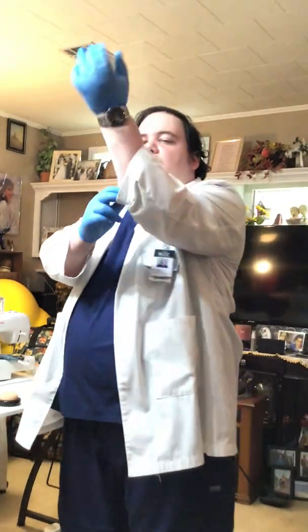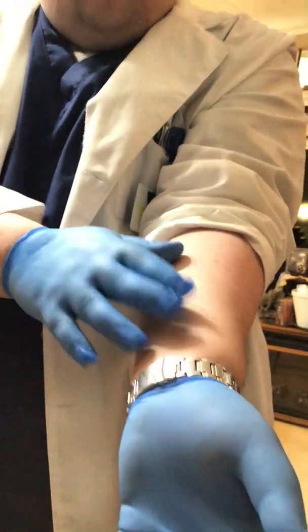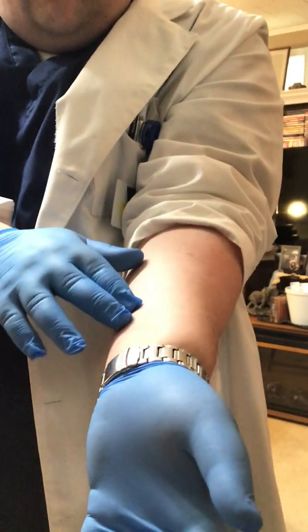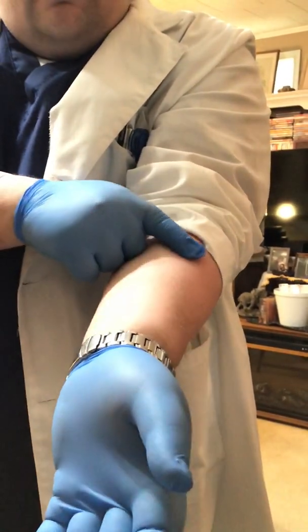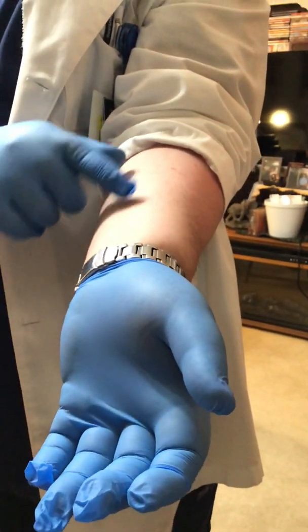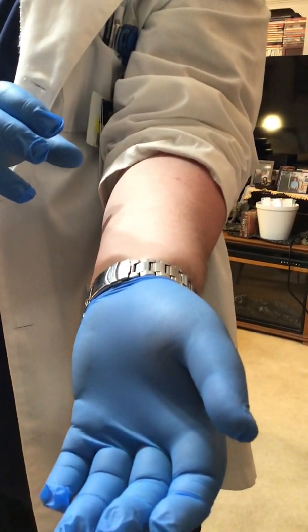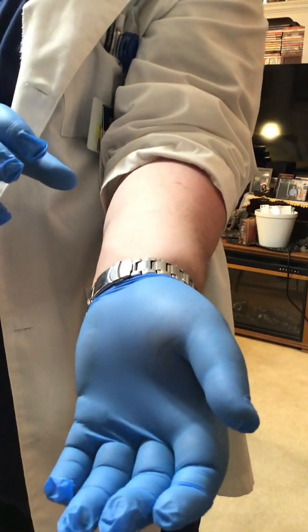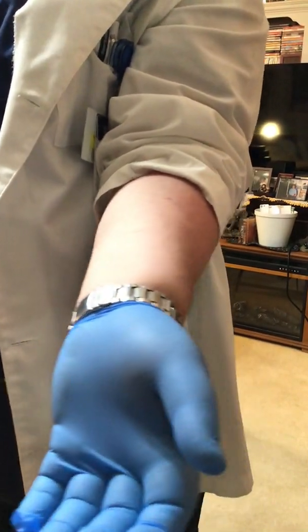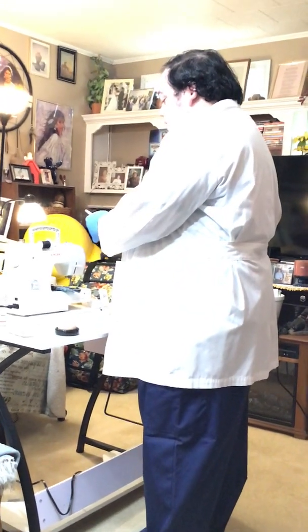Okay. So, our last injection is our PPD skin test, which is going to be an ID injection. Let me show you this on the camera. We're going to go somewhere around here. If the patient's arm looked like this, I'd be very careful because I see some scars here. I don't want to put it anywhere that a scar may be mistaken for the result, because we're going to put the tuberculin, the PPD, in there, leave it for 48 hours minimum, and see if it has some type of reaction, much like an allergy test.